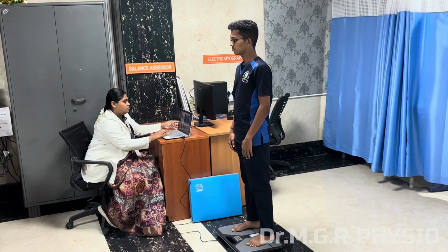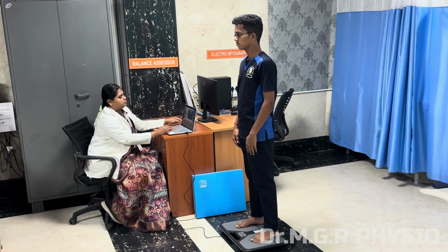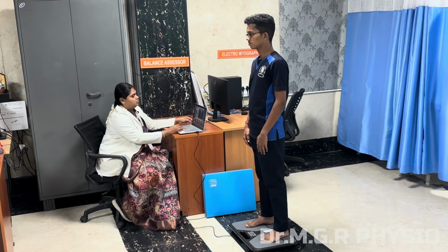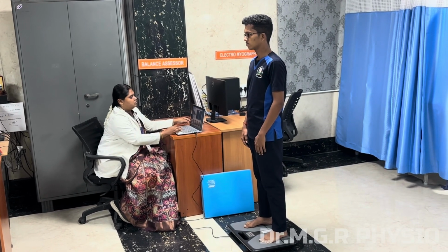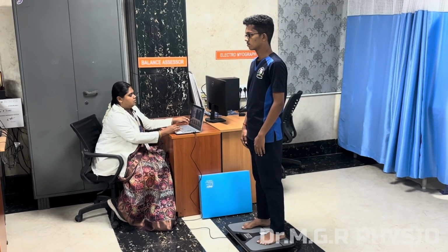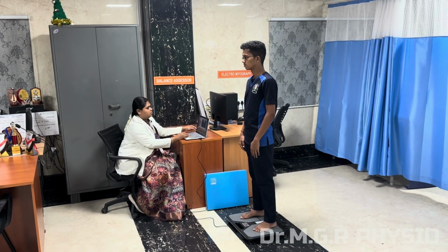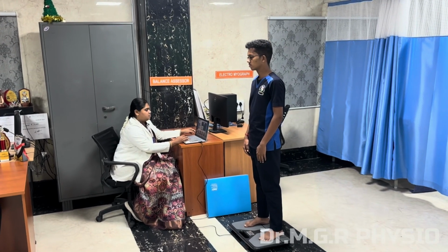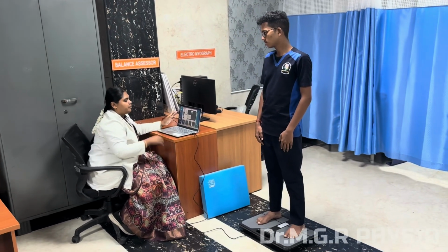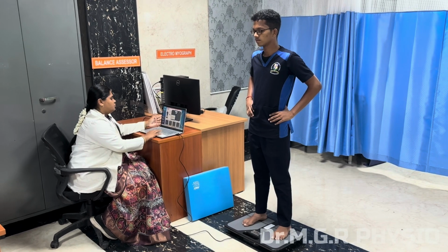Open your eyes. Relax. Now eyes closed, keep your hands on your hip. Yes. Eyes closed.